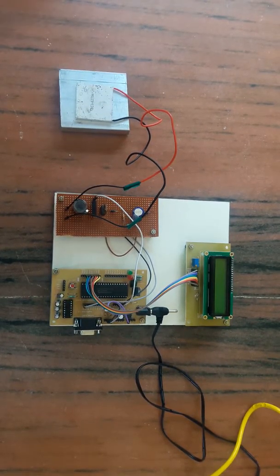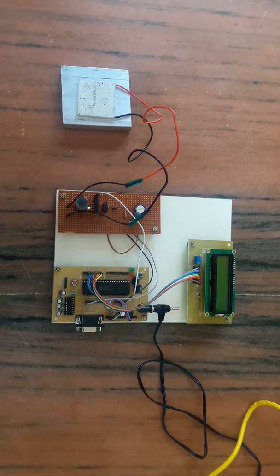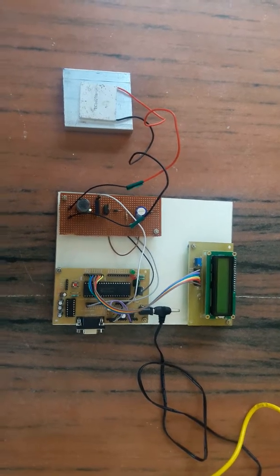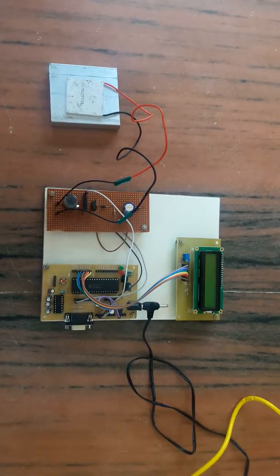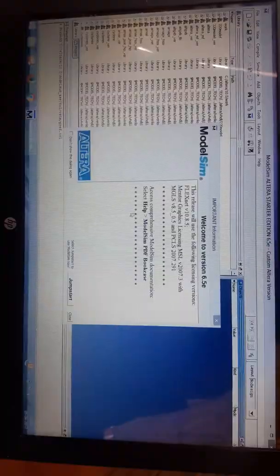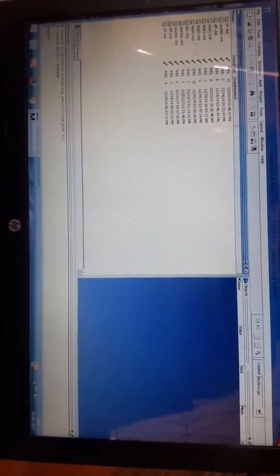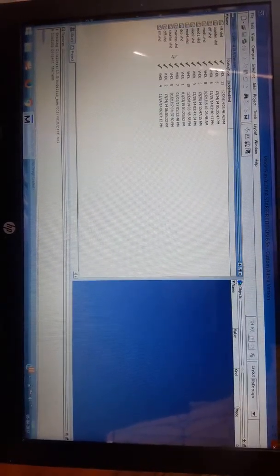To check the heart rate, the human heart pulse cannot be given in a demo. So a PWM pulse is given, which is similar to the human heart pulse. The PWM pulse is generated using VHDL in ModelSim.